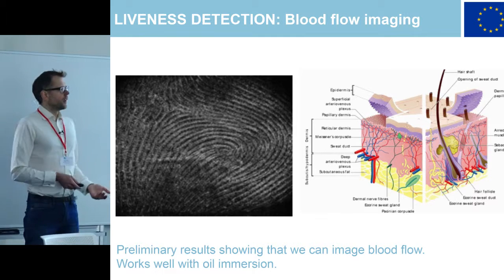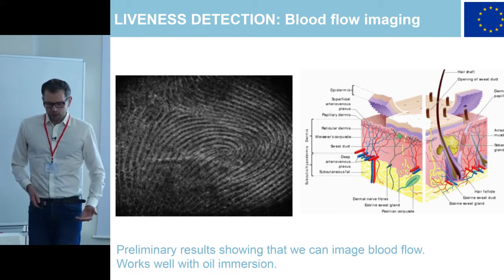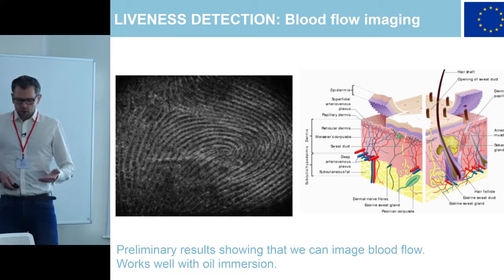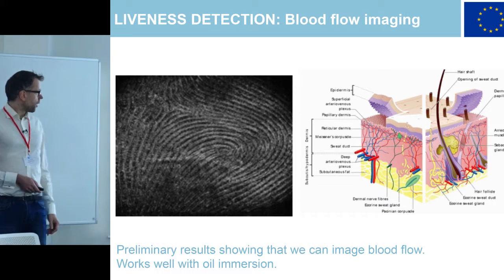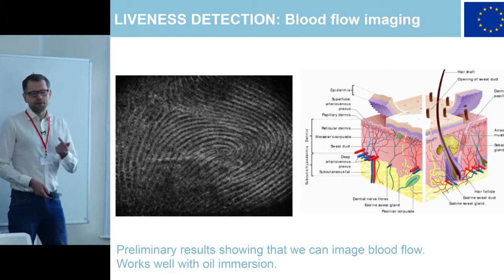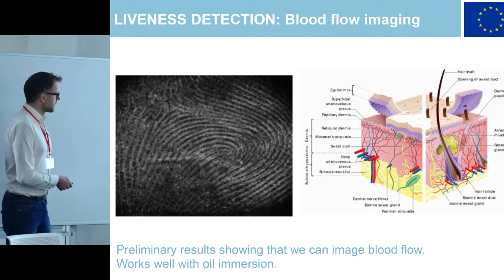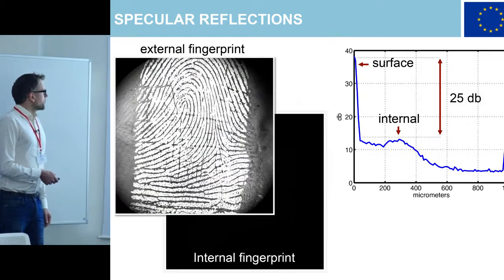So sometimes in biometrics, companies that make those devices try to come up with different solutions for liveness detection, to see if a person didn't bring a dead finger or something of another person. It happened actually before. This is a portable version.